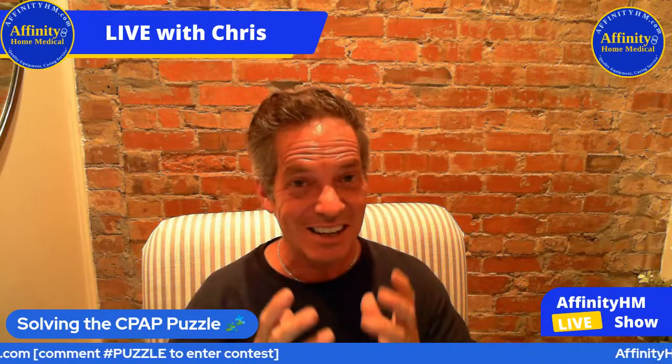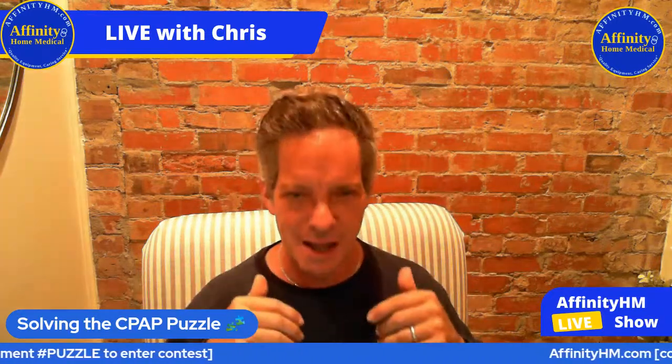All right. Georgette is asking a question here. How tight is the mask supposed to fit on your head? Well, really, what you want is just as loose as possible without a leak. Now, I have seen some people put the mask on without turning the machine on, and it's just so tight that there's literally no way it's going to leak. However, you're going to be uncomfortable. So that's why I say turn the machine on and gradually tighten it until the leak stops, and then try turning your head up and down, left and right, and that's where you have the best possible situation.